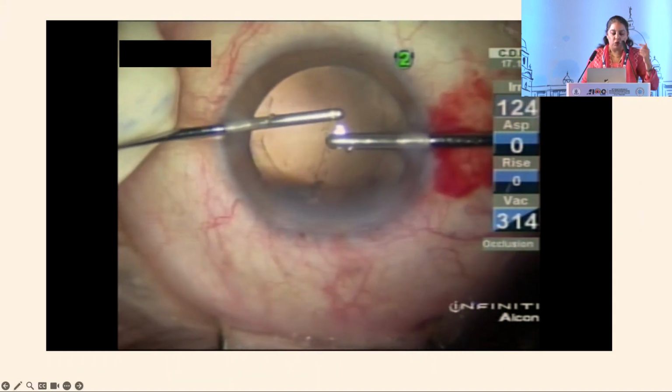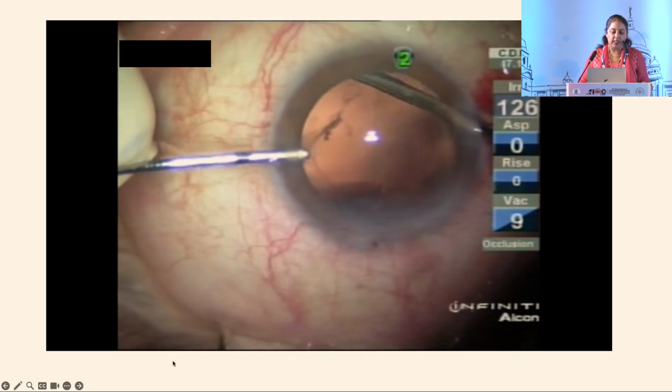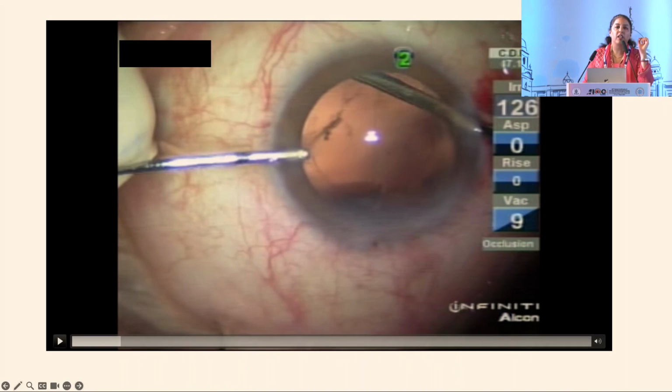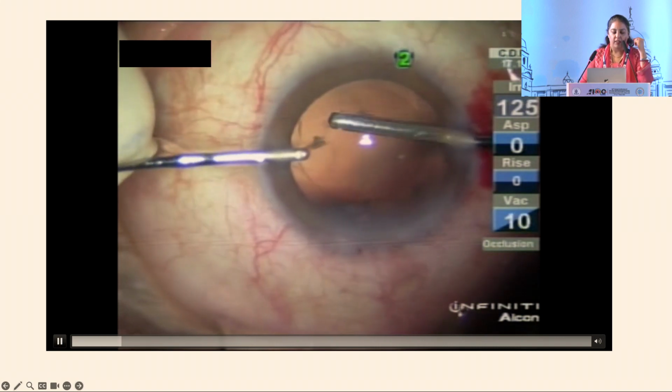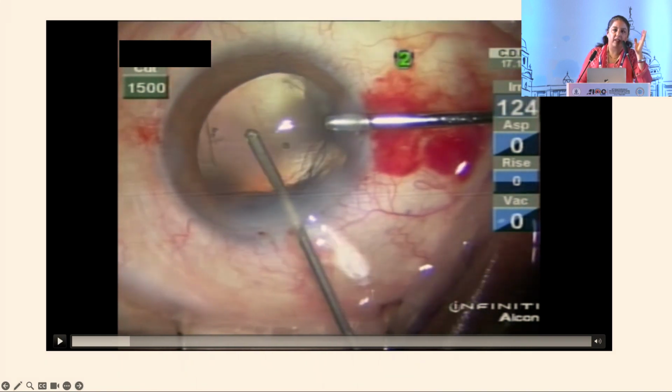Doing these maneuvers with vitreous, you see here that the vitreous is actually being dragged. This is a tag of vitreous that is being dragged. When you drag the vitreous, you're pulling on the peripheral retina, which can lead to tears or detachment. So this is something that you don't have to do. Do not aspirate the vitreous. Switch to a cutter and do not sway your instrument thinking that you can pull the vitreous and shred it. Absolutely counterintuitive. Now the surgeon moves to a vitrectomy approach. What is the problem here is that the vitrector has been inserted through the main port.